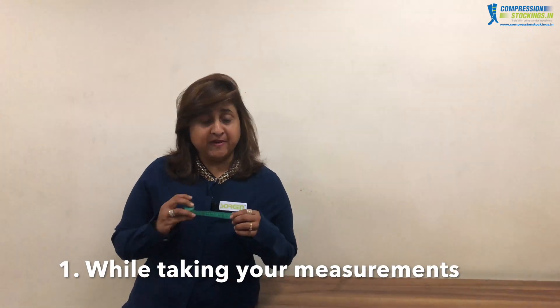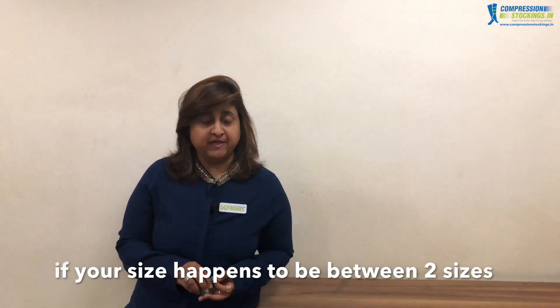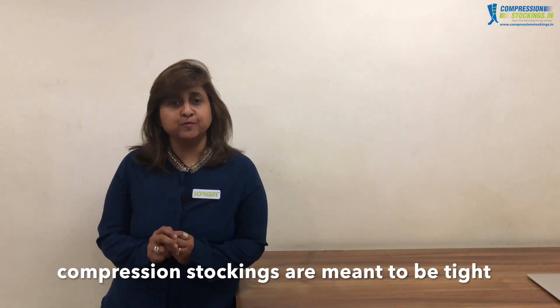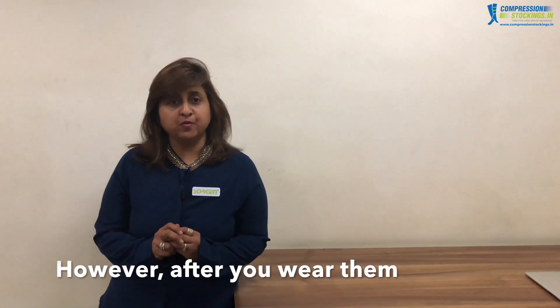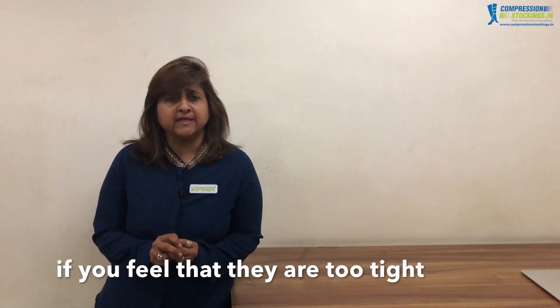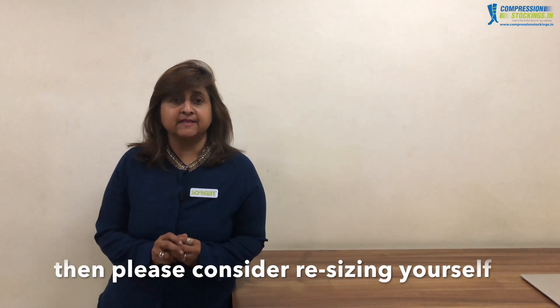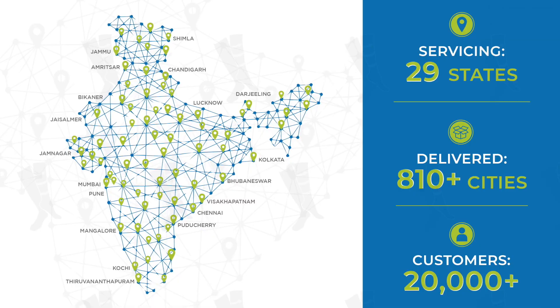There are two things to note. One: if your measurements happen to fall between two sizes, it is always advisable to go for the larger size. Two: compression stockings are meant to be tight; however, if after wearing them you feel they are too tight and extremely uncomfortable and wish to remove them, please consider resizing yourself. Thank you.